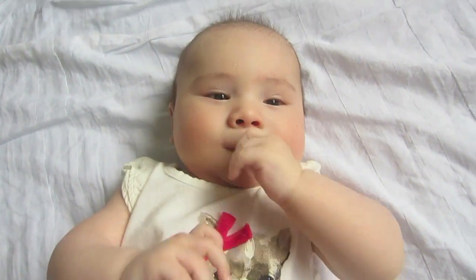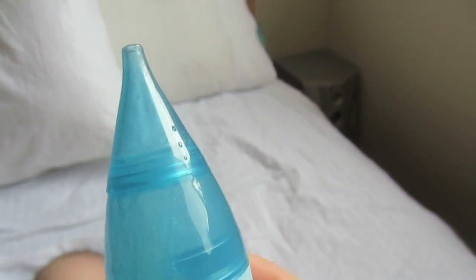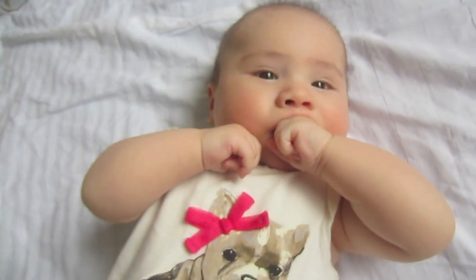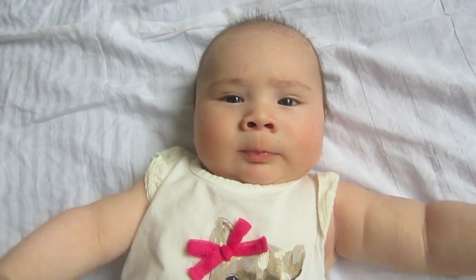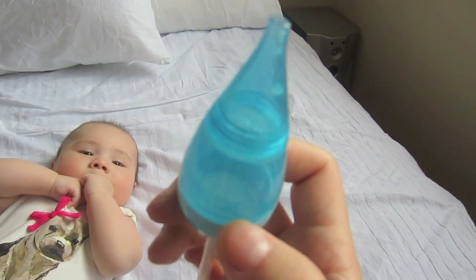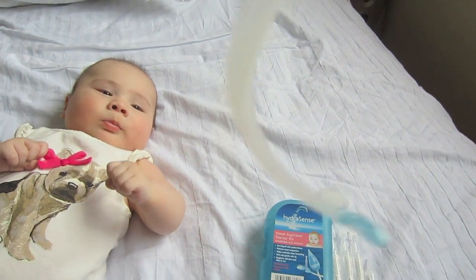And there you go — this is kind of disgusting, but right there is all that mucus and snot, and now your baby can breathe easily. Make sure after every use you throw the filter away and sterilize the aspirator, especially the mouthpiece.